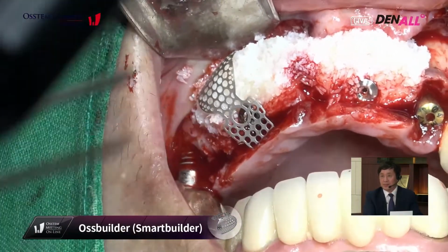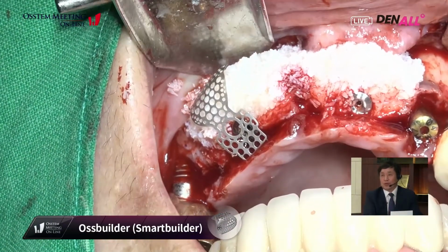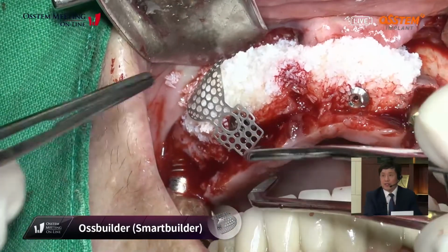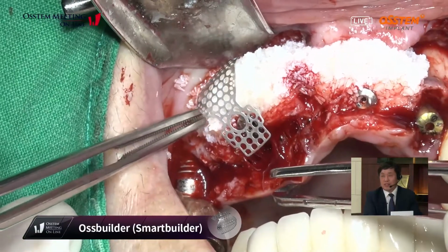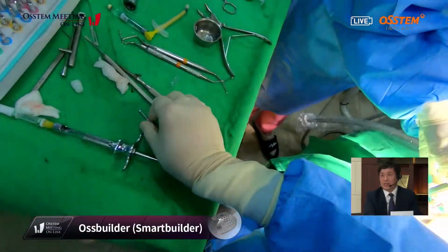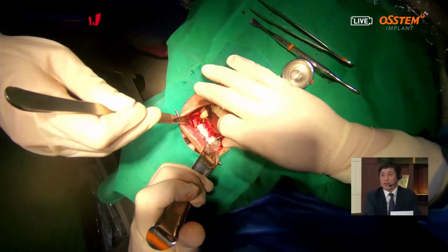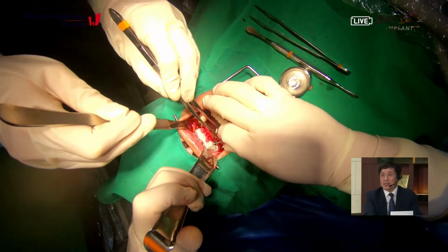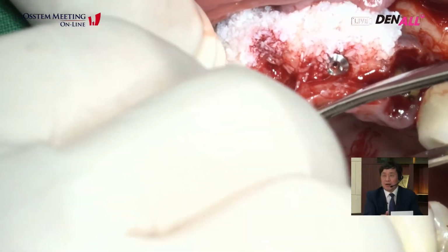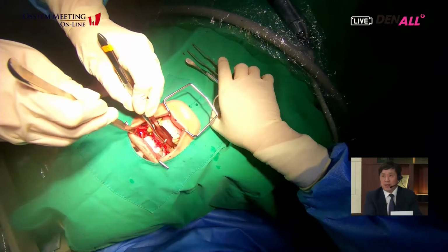Now I'm placing. He wants more than 2 millimeters of labial bone, so he augmented abundant bone with the allogenic bone, the bovine bone and the xenogenic bone graft materials. It's a sandwich graft technique. And the application of the Ossbuilder. This Ossbuilder has labial side augmentation, also with augmentation for the palatal side.